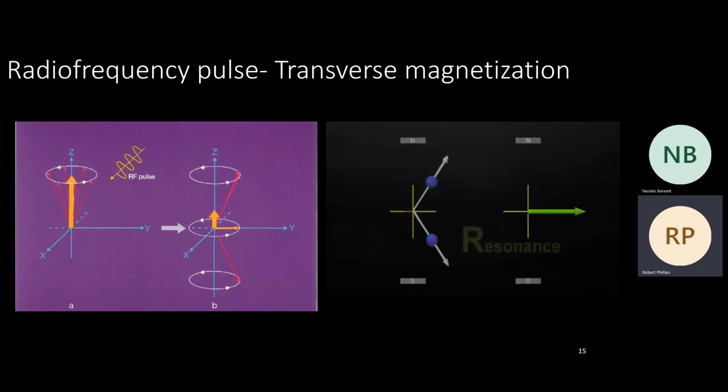So this is called resonance. Is it clear? Any questions? So the Larmor frequency that's applied, is that the Larmor frequency of water? Water. Okay. Yeah.